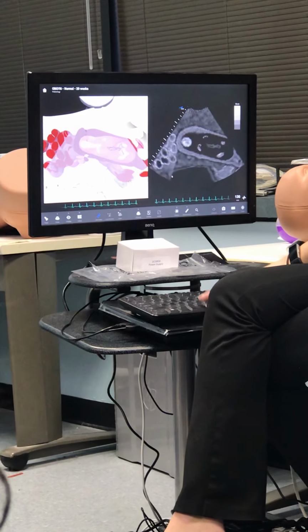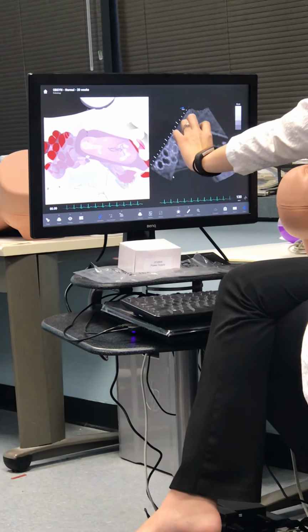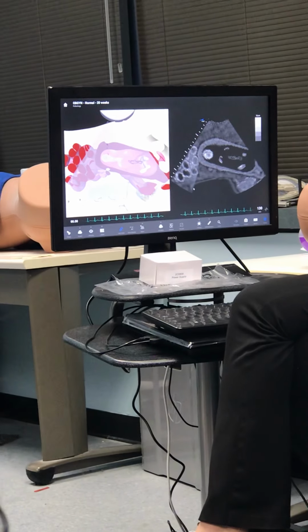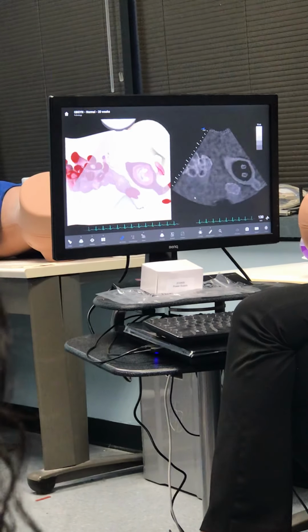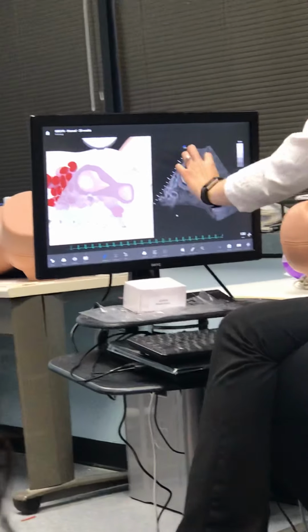Okay. Fluid. Do this part of it because it'll be the upper portion. This is cervix, which will be lower portion typically. Okay. That would be your left upper quadrant. Like in between the head and whatever that is. Yeah, like this part of it.